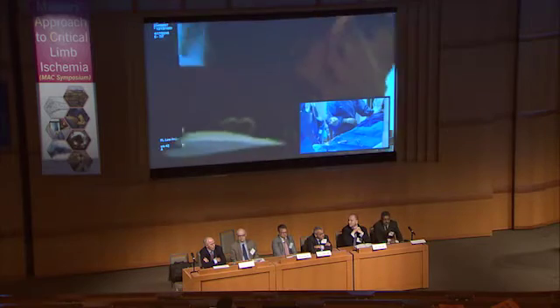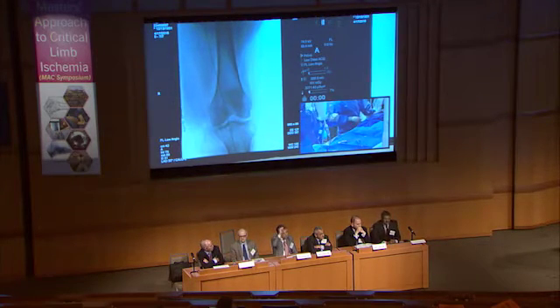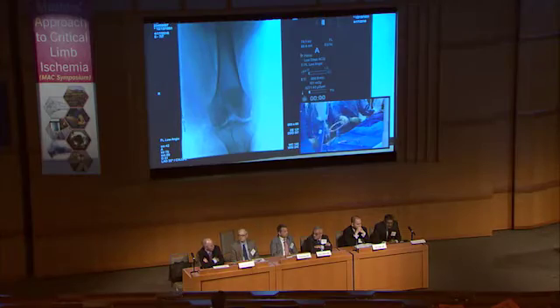Yeah, I think it's a great case. I think the fistula really made the disease look a lot worse than it actually is, because most of the flow was going into the veins rather than down the leg, and it's a relatively straightforward fem-pop lesion. And then there's significant infrapopliteal disease that needs to be treated, both in the AT, a short segment occlusion, and some severe disease in the PT. So I would treat it all. I think normally we would start with a drug-coated balloon for the SFA and then selective stenting as needed. In this case with the fistulas, maybe a Viabahn, as Thomas mentioned, and then we would treat pretty much every vessel we could below the knee and try to open everything up and maximize the chances of healing since there's such significant tissue loss.